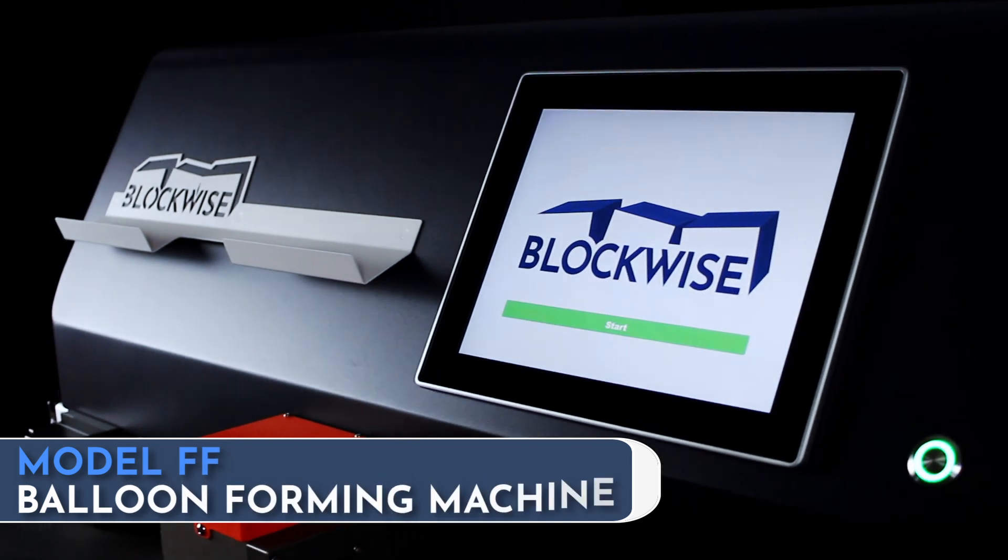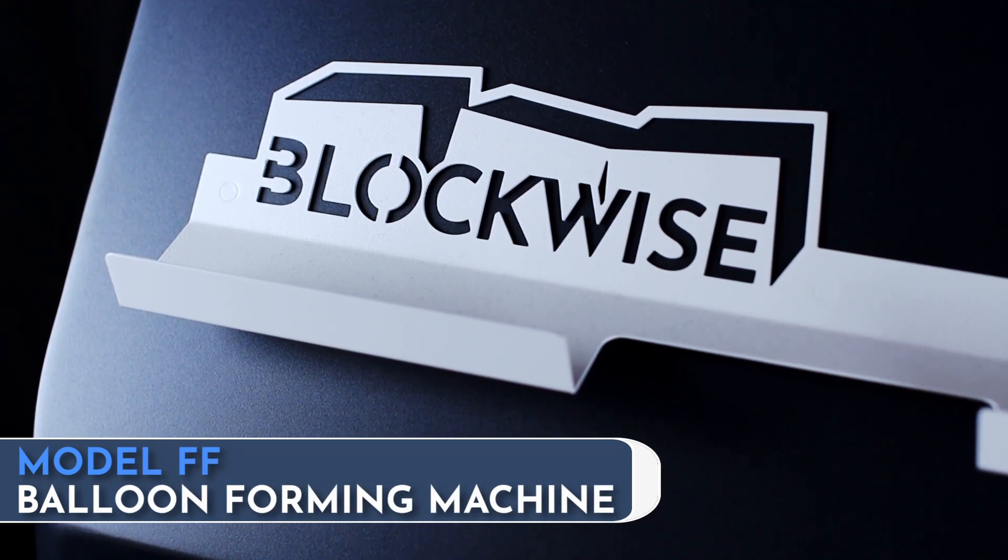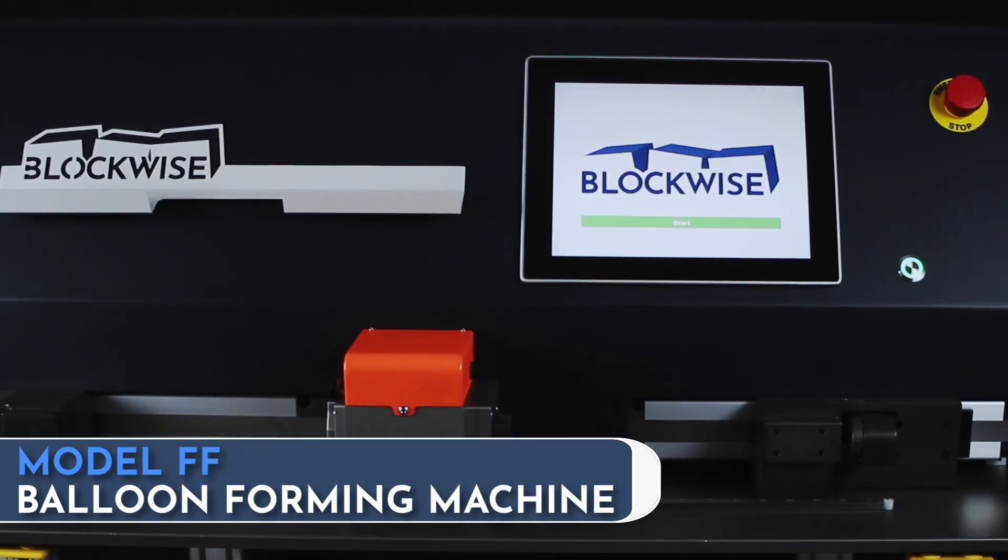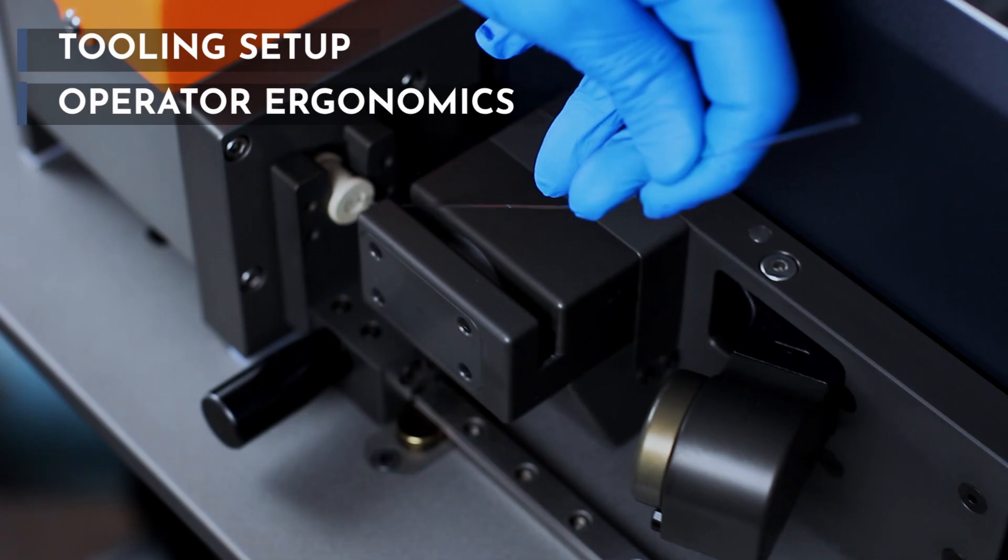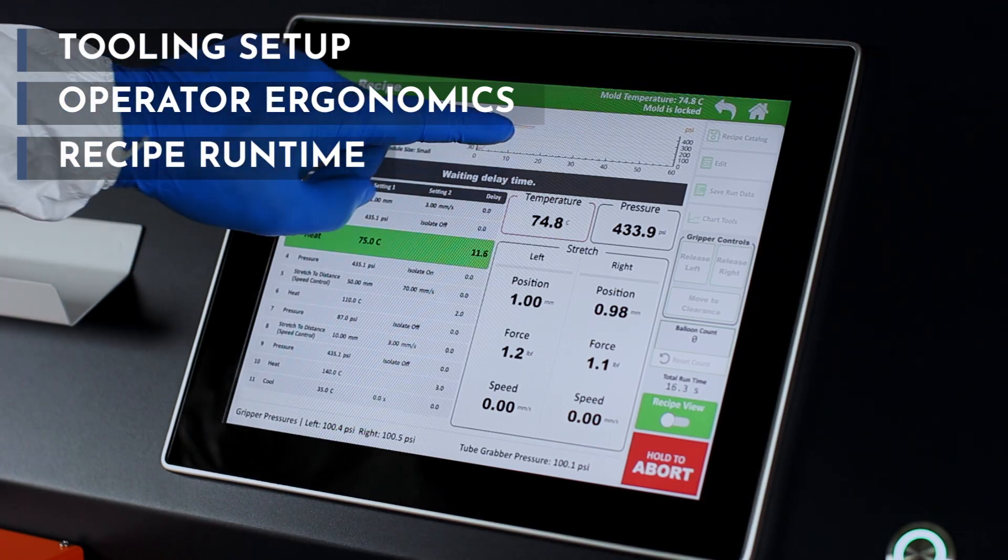The Model FF balloon forming machine from Blockwise Engineering drastically improves manufacturing cycle times through innovations in tooling setup, operator ergonomics, and recipe runtime.